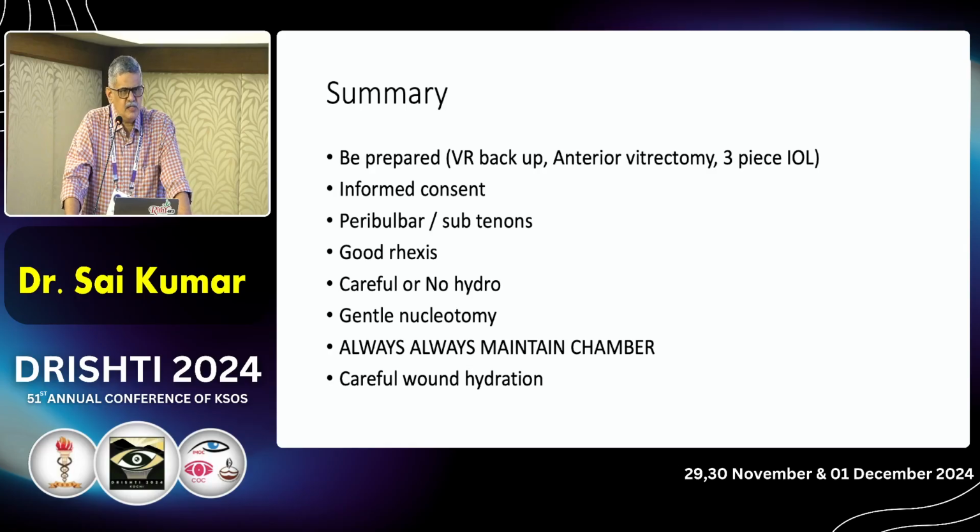Get an informed consent from all your posterior polar patients. Even if you think it is not a typical posterior polar, and I can get away with this, the PC may not break. It's always safer to inform the patient that you have a capsule which is likely to give you problems, and get an informed consent. Either do a peribulbar if that is the practice in your institute, or you go in and if necessary give a sub-Tenon block, which is very simple, very effective.